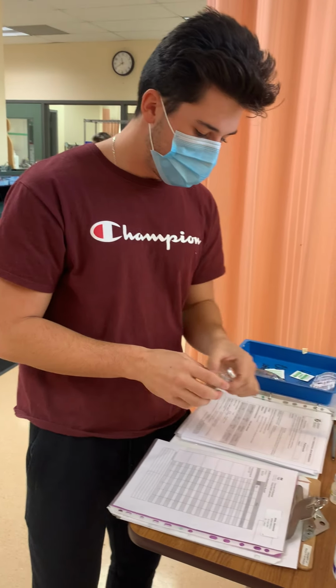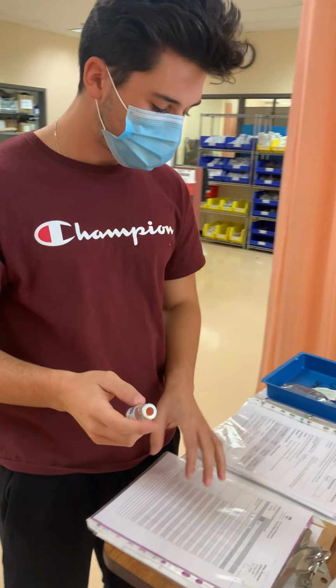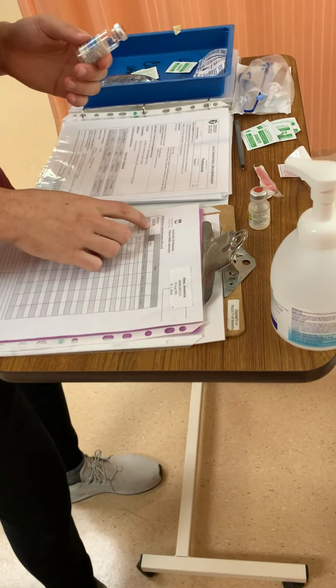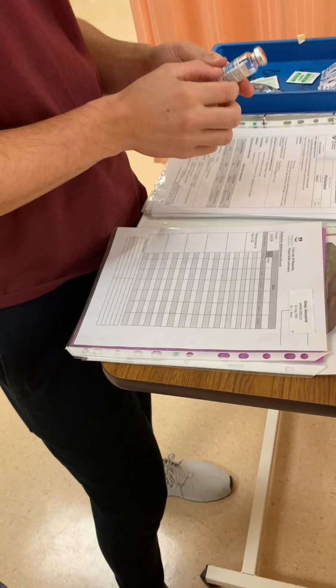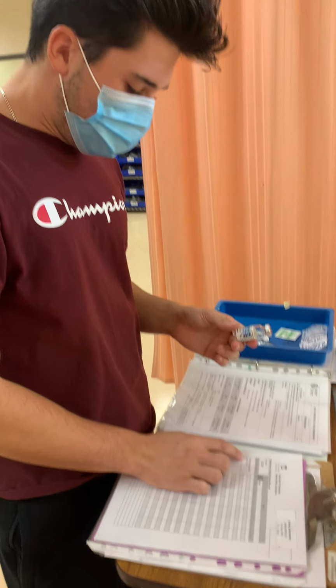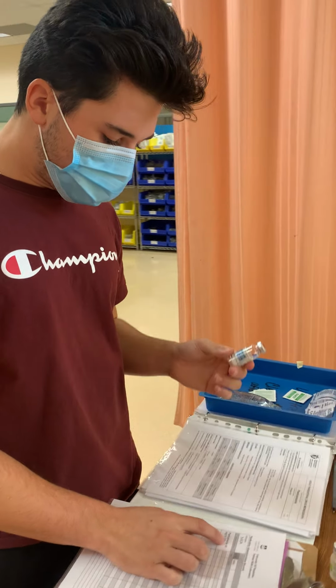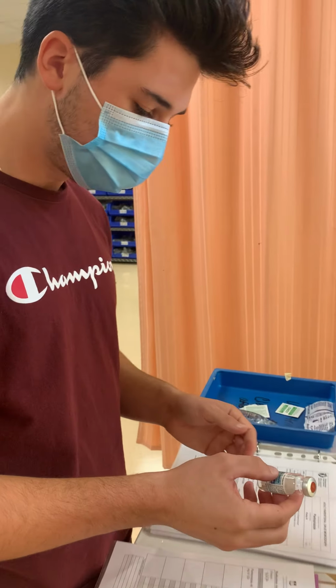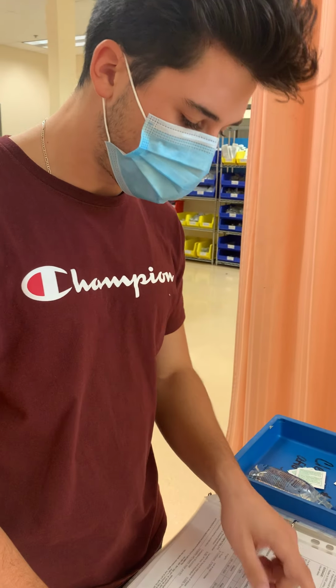So I've grabbed my Pantoprazole that I'm going to need, so I can do my first check. For VV, who has no known allergies, we have Pantoprazole 40 milligram vial for 40 milligrams. It states that it can be given IV, and it's to be given now. It has not been given yet. So I'm going to set this down and look at my drug monograph.